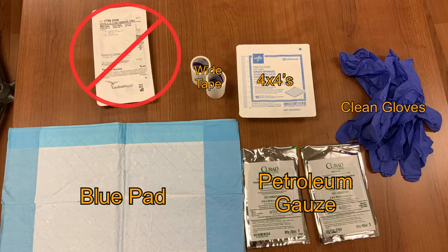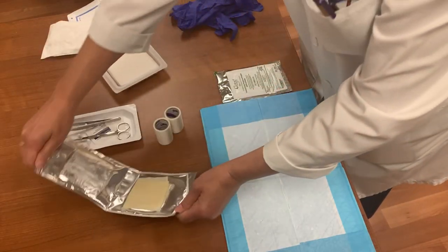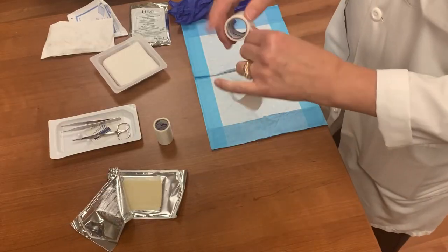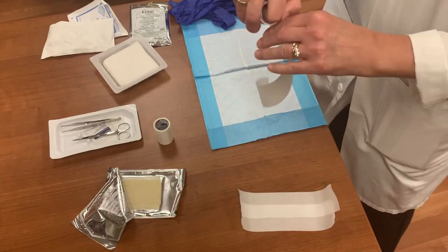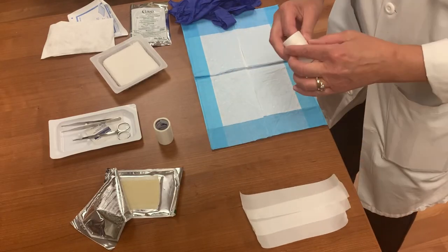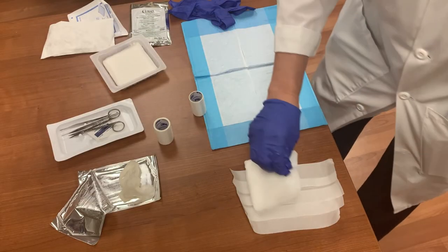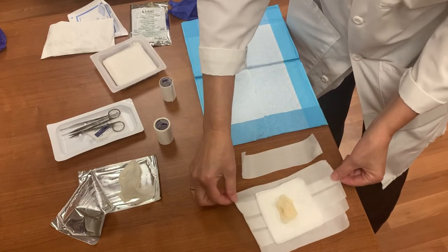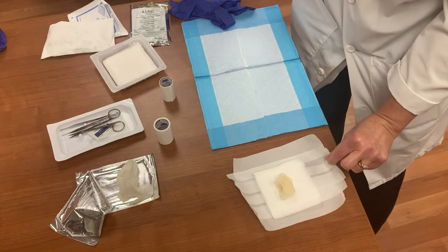Begin by preparing the dressing. Open the 4x4s and the petroleum gauze. With the tape, create a large sheet by overlapping strips. The sheet needs to be large enough to contain the 4x4s and still have enough tape surrounding the gauze to adhere completely to the patient on all sides. Place the 4x4s in the center of the tape sheet. If it isn't large enough, continue to add strips of tape to the sheet until it is adequately sized.